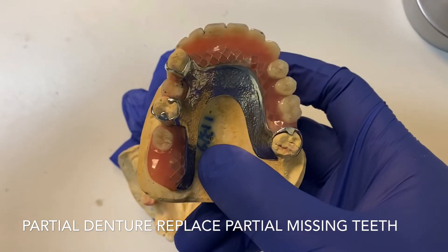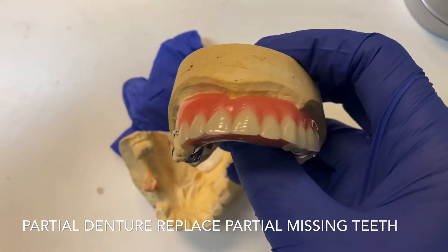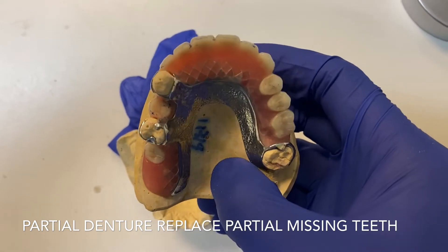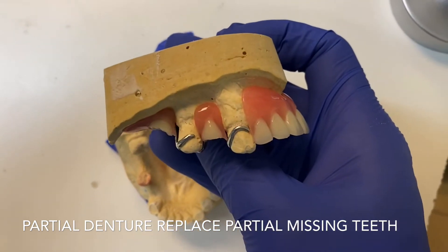How it can replace your missing teeth. This patient is in his 60s and he just wants to have a partial denture so he can use it to eat and smile, and this is what I can offer for him.